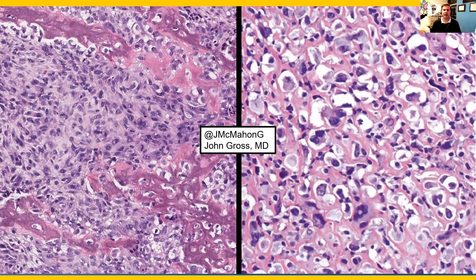We'll start with osteoblastic osteosarcoma. On the left is an intermediate to high-power view of a malignant tumor with brisk mitotic activity producing osteoid matrix, which has mineralized — this pink and purple material. On the right is a higher power view of these malignant cells that are anaplastic in morphology, directly producing this wispy, lace-like osteoid matrix. That's the definition of osteosarcoma: a malignant cell directly producing osteoid that is mineralized.